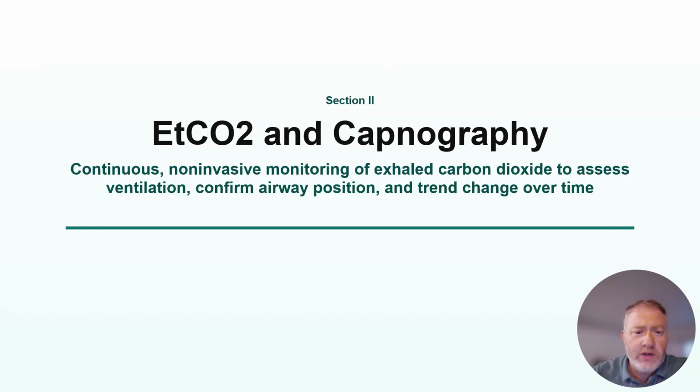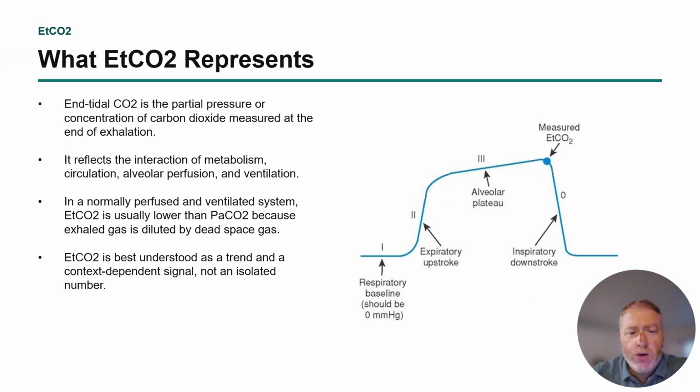Let's move to end tidal CO2 and capnography. So what end tidal CO2 represents, and end tidal CO2s have really come on in the last decade or so. I recall when I was first bedside, we used them kind of sporadically, and they were kind of a pain and weren't really reliable. But in the last 10 years or so, they use end tidals very frequently, and it's something that's easy to put in line and easy to monitor when it works, and it doesn't always work.